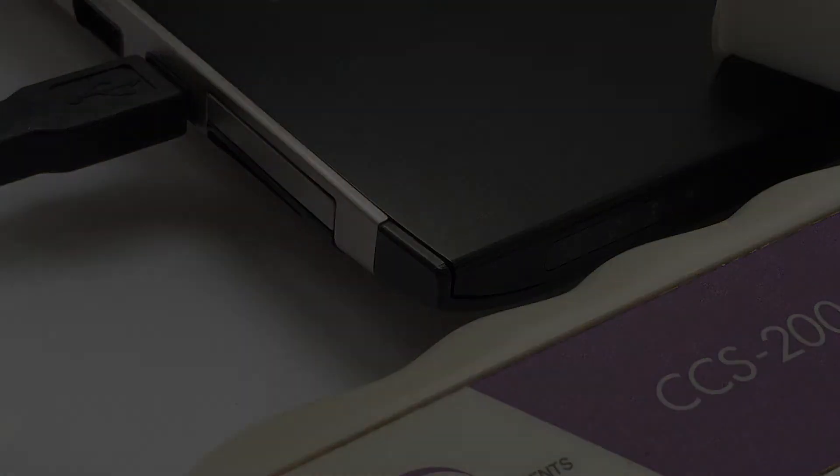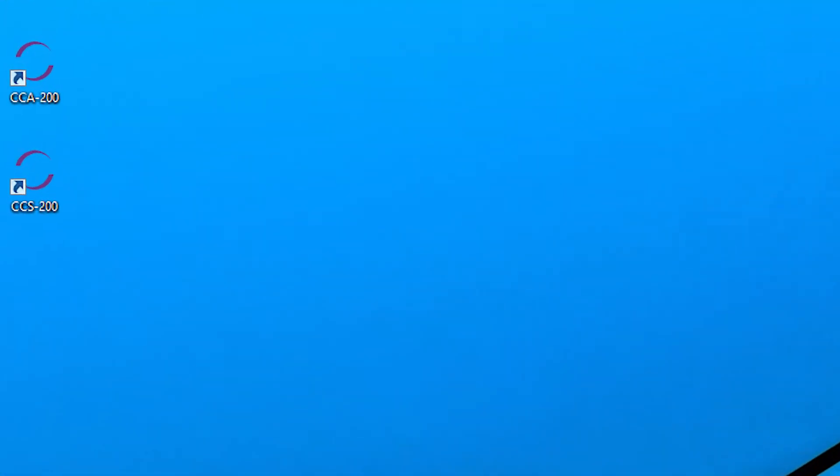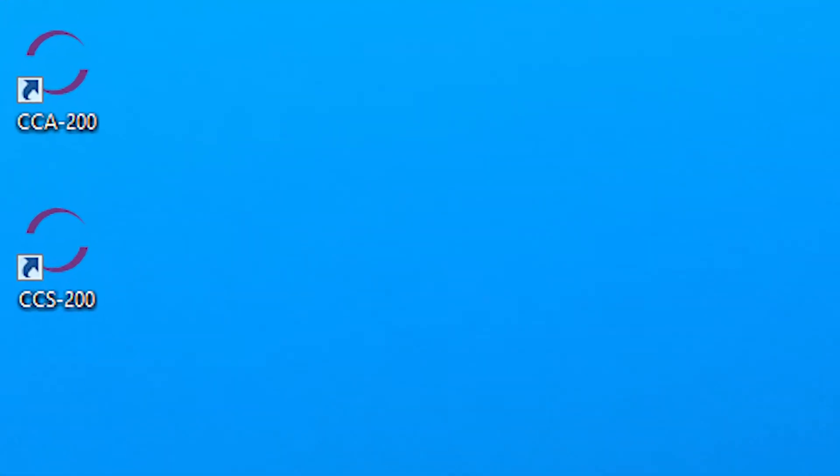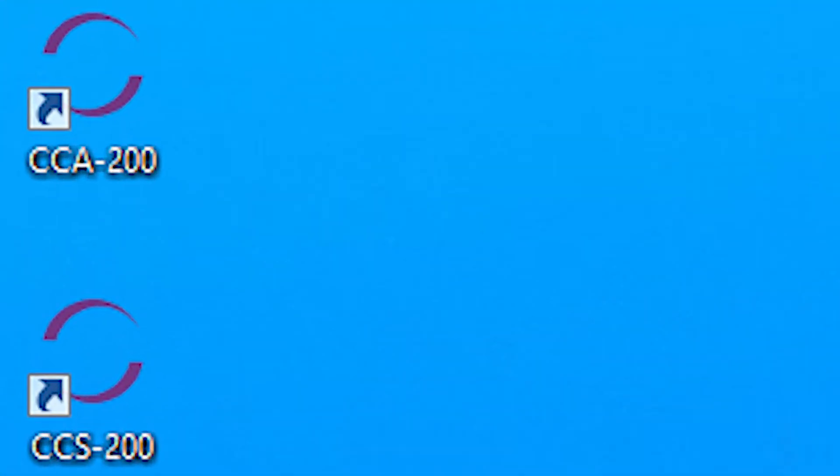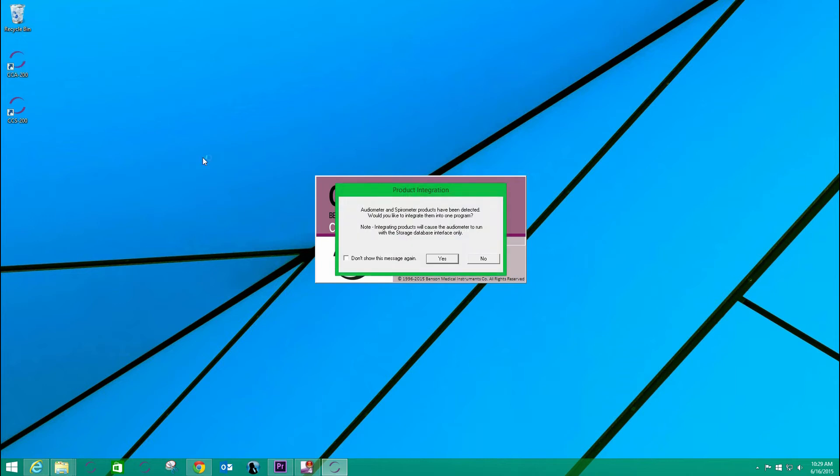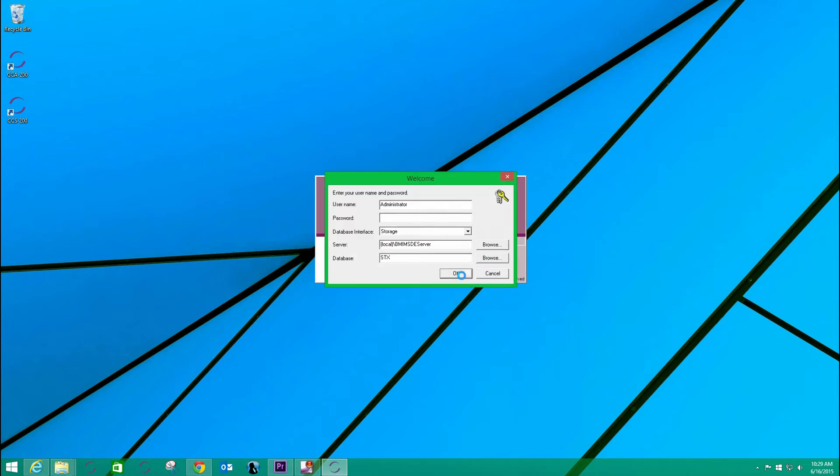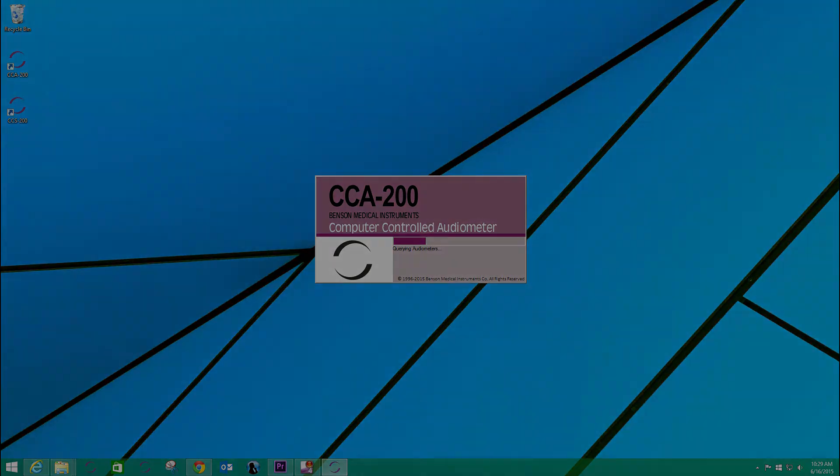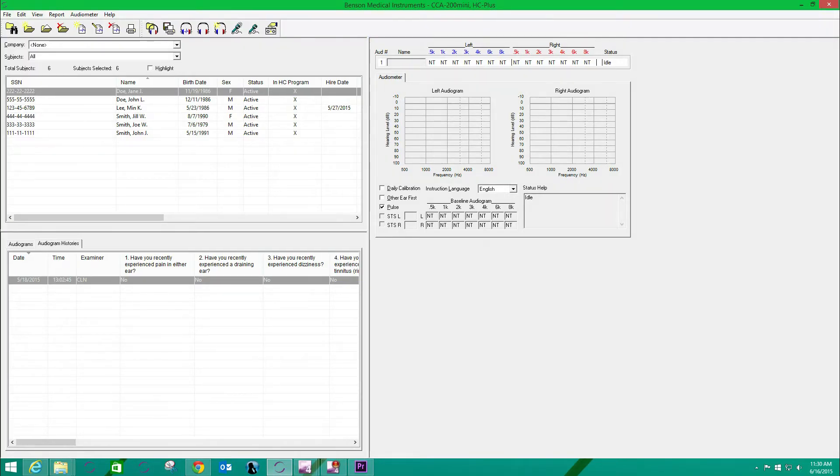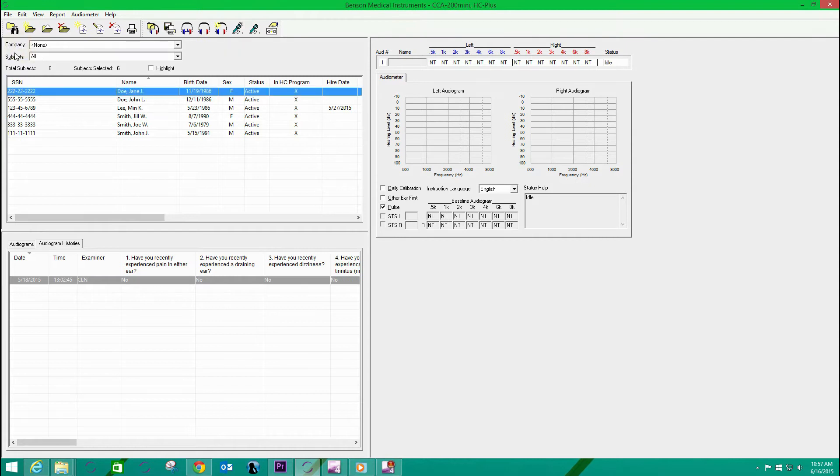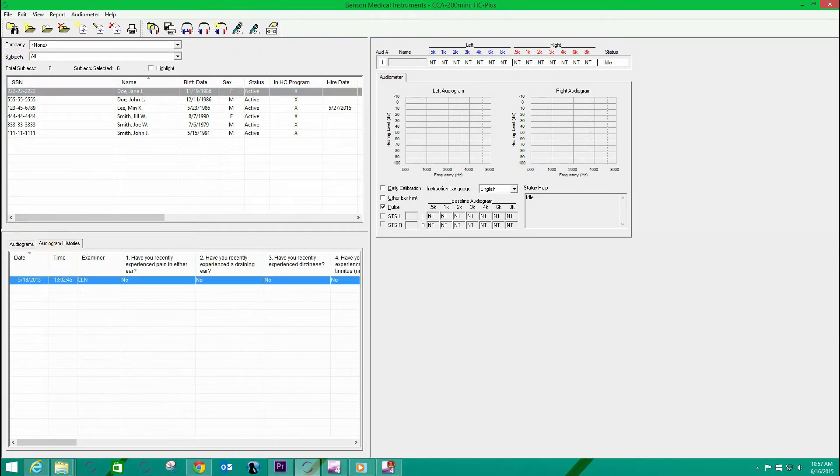Let's look at how this works. Each instrument software application is installed on the PC, and the two program icons appear on the desktop. When I double-click the CCA200 icon, the audiometer software is launched, and I can see the instrument control in the right panel, as well as the database view with companies, subjects, audiograms, and histories in the left pane.